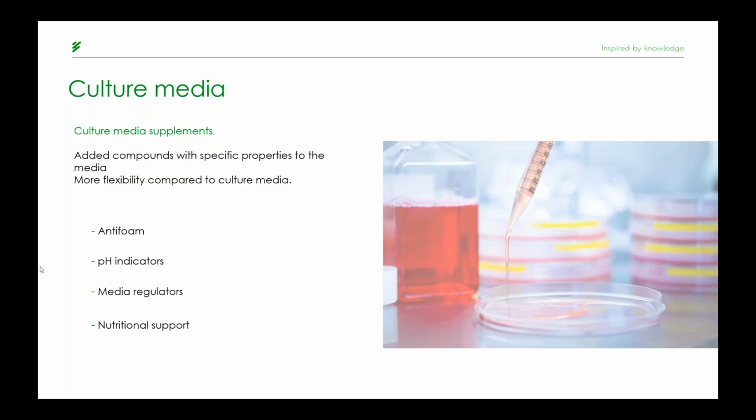Then there are media regulators, another kind of supplements that help with the accessibility of the nutrients. And then there are so many kinds of supplements that can be used as nutritional support to enhance the growth and the synthesis of products.